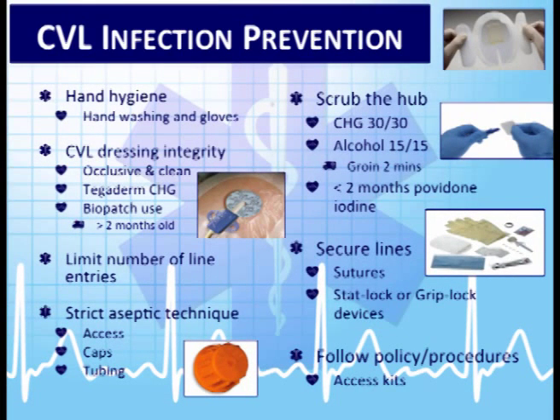So what can we do to prevent the infections? We know that infections are a huge thing. We want to do what's in the best interest of our patient and be a patient advocate. So hand hygiene is the biggest thing.